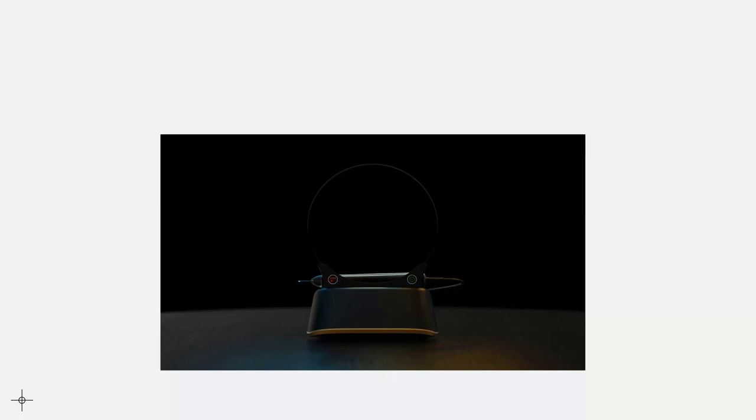There was something inside the laser when you put it in pulse mode where the laser would go on and off and on and off. But it would happen so quickly that it was imperceptible to the eye. So it was more like on, off, on, off, like that. The advantage of that is when the laser was on half the time and off half the time, you could do certain procedures without anesthetic. It was much more comfortable to the patient. So if you had your laser in pulse mode and you were at 1.5 watts, you get an average wattage of 0.75 because it was what we would call a 50-50 gated pulse. The laser was on 50% of the time and off 50% of the time. Would it still cut? Yes, it would cut quickly. But it was on, off, on, off.